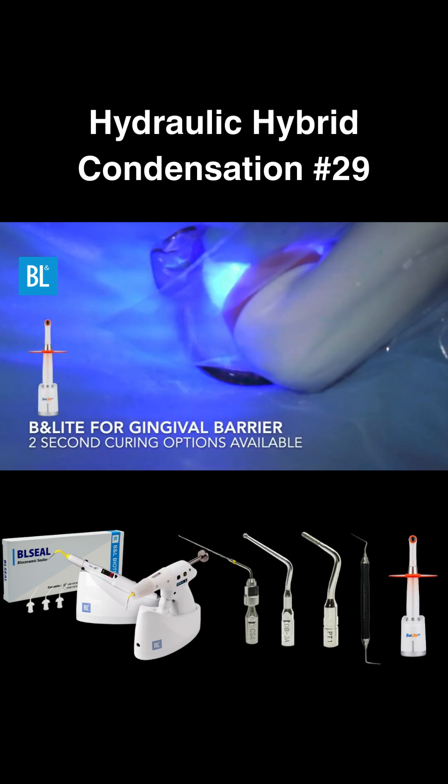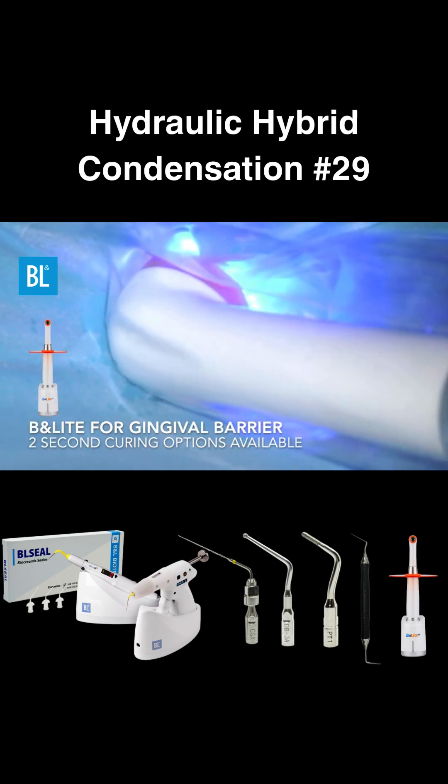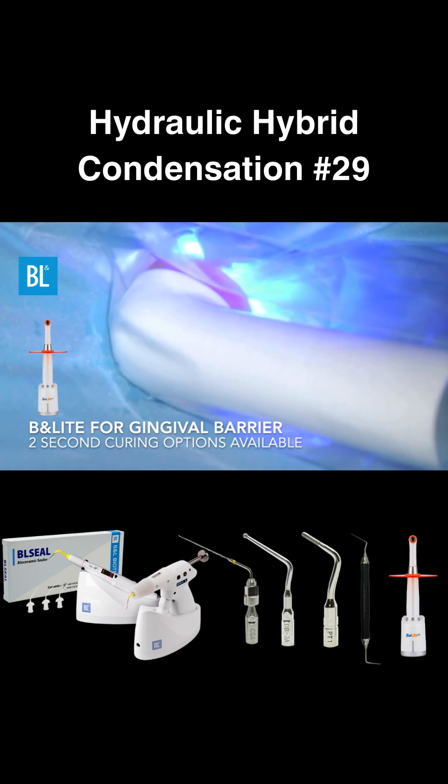To start, use the BN light to cure the gingival barrier for secondary isolation. The BN light features a rapid 2-second curing mode.